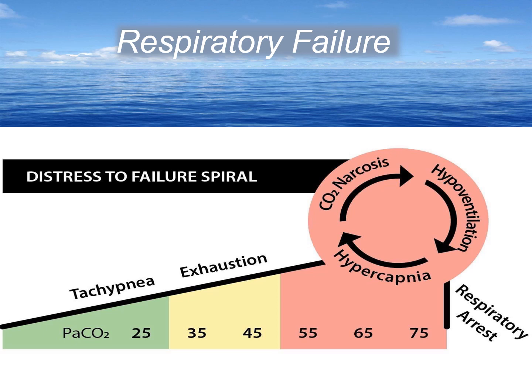For patients who present with high end-tidal CO2 readings, a decrease with treatment indicates that they are getting better. No change or a rising end-tidal CO2 level indicates that the respiratory effort is still failing to adequately eliminate CO2, and other interventions are needed. A patient receiving supplemental oxygen may need CPAP, and patients whose end-tidal CO2 rises with CPAP may need assisted ventilations with a BVM. End-tidal CO2 levels that are greater than 70 millimeters of mercury in patients without COPD indicate respiratory failure.